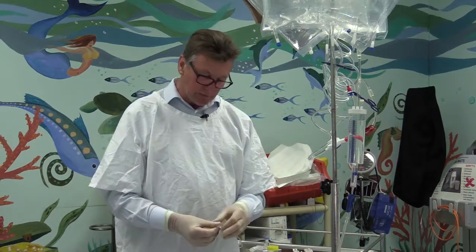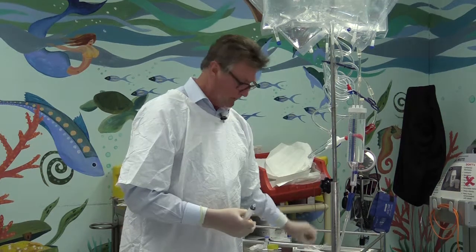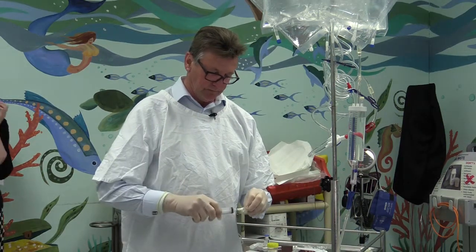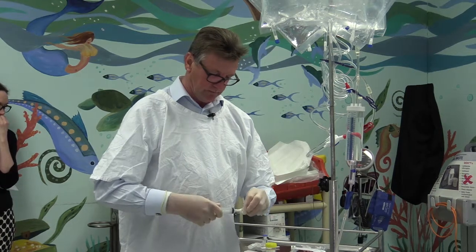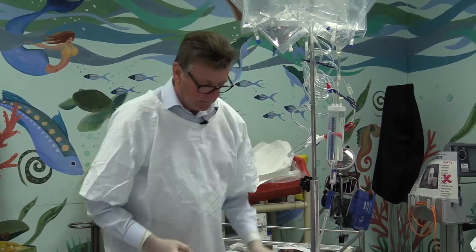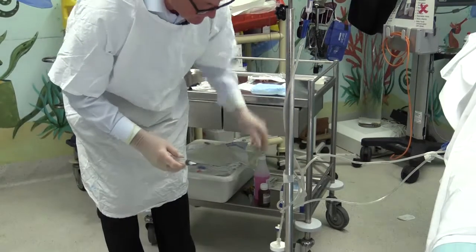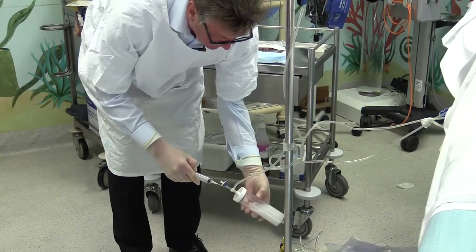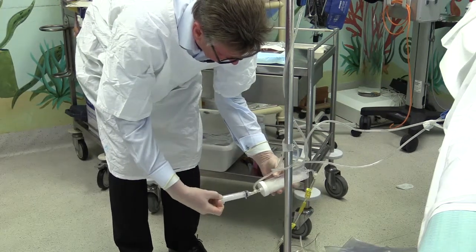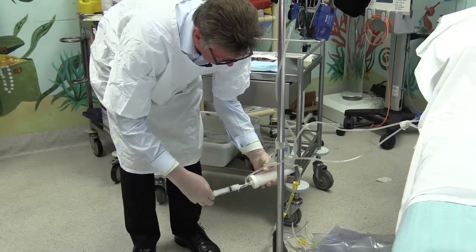We need a 20 ml syringe. Using an aseptic technique, a large bore needle, having swabbed the top of the burette, the sampling port, we can now invert the burette, and we'll take out a 20 ml sample of fluid.